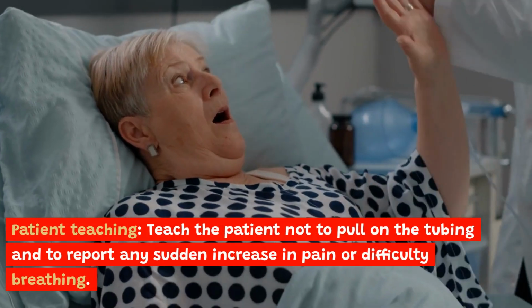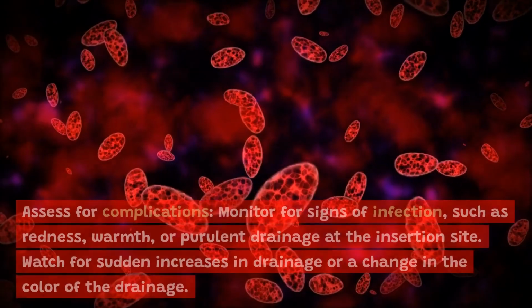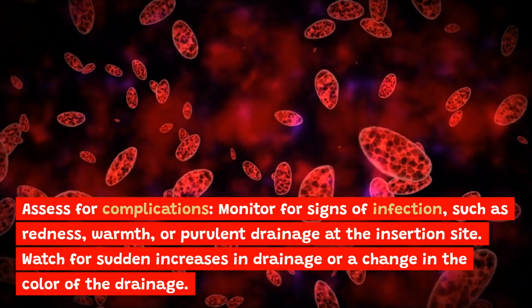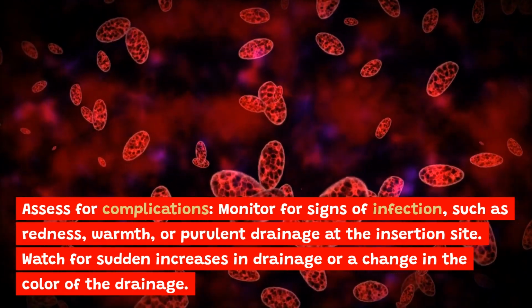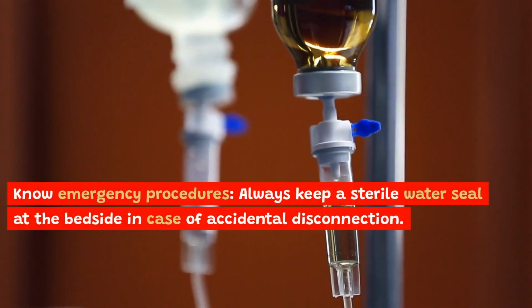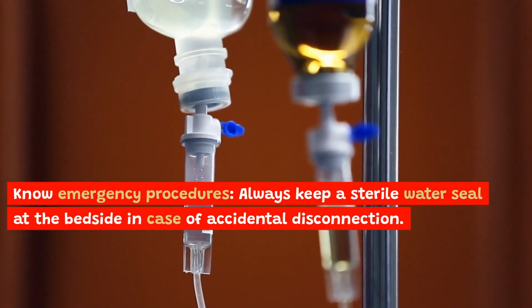Patient teaching. Teach the patient not to pull on the tubing and to report any sudden increase in pain or difficulty breathing. Assess for complications. Monitor for signs of infection, such as redness, warmth, or purulent drainage at the insertion site. Watch for sudden increases in drainage or a change in the color of the drainage. Know emergency procedures. Always keep a sterile water seal at the bedside in case of accidental disconnection.